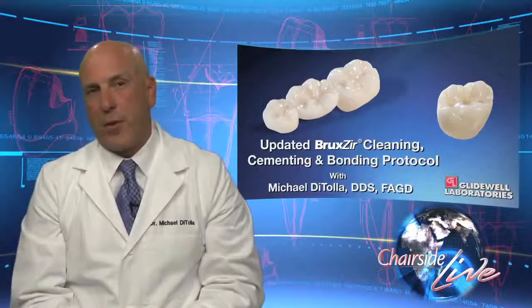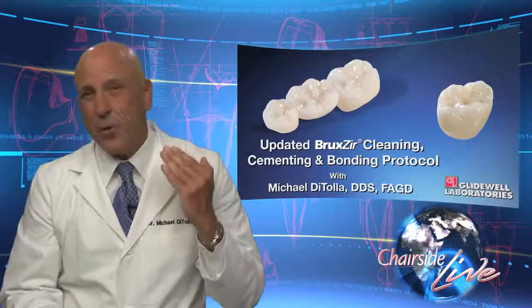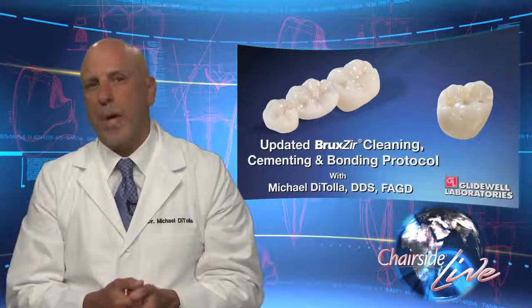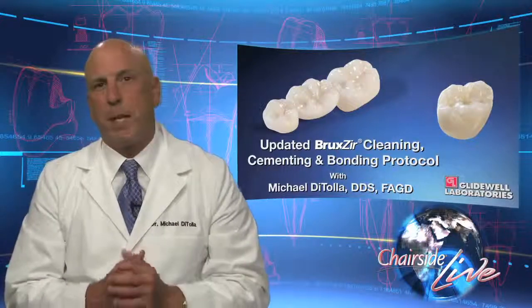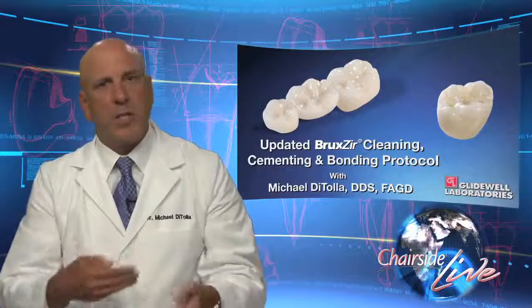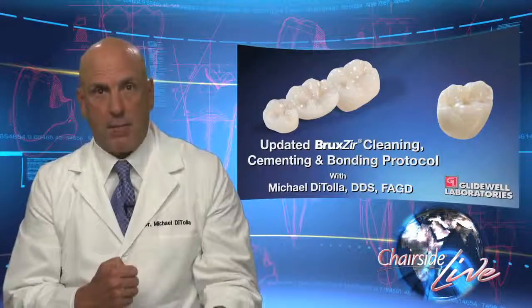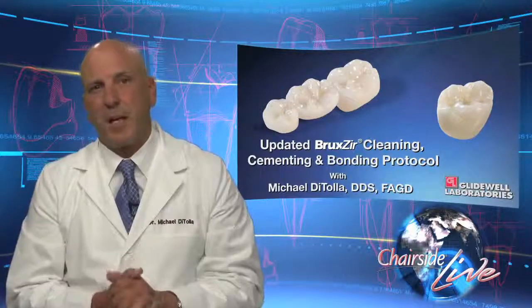A lava crown, on the other hand, needs 1.5 millimeters to 2 millimeters of reduction. So you never use a lava crown on a lower second molar, for example, probably not even a lower first molar, although if you did, you would probably have a prep that was about 4 millimeters tall, and so mechanical retention would not be a big deal. It's because of the fact that BruxZir is so strong and we can use it in so many demanding clinical situations where we have short clinical crowns that there's more of a tendency for those crowns to come off. It's the same zirconia. It's got nothing to do with that and everything to do with the prep design underneath those crowns.